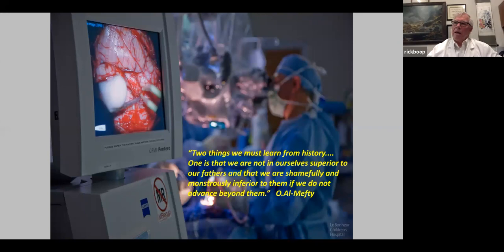As you know, there are a number of centers that are using 5-ALA or fluorescein to look for residual tumor. In my practice, I generally take care of children, and in our country, 5-ALA is only approved for 18 years old and older. So we rely on intraoperative MRI to look at residual tumor, and have found that very effective in reducing our need to return to surgery for residual tumor.